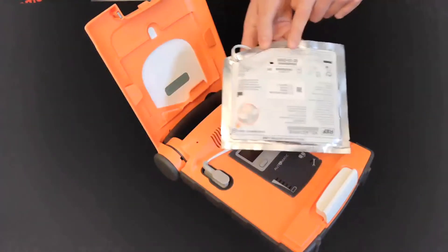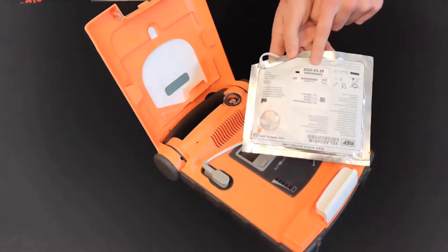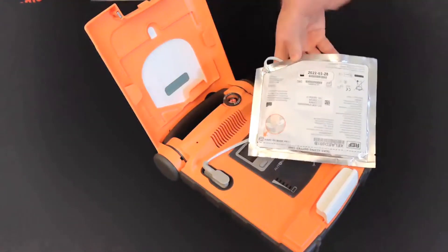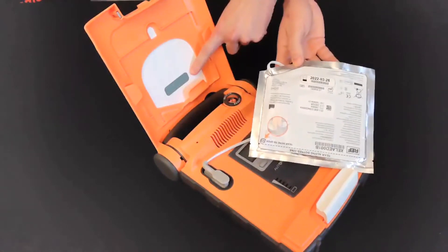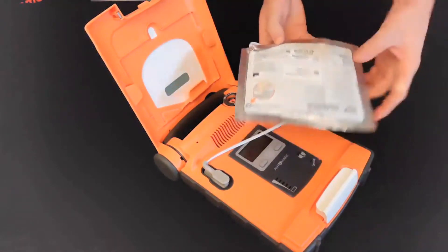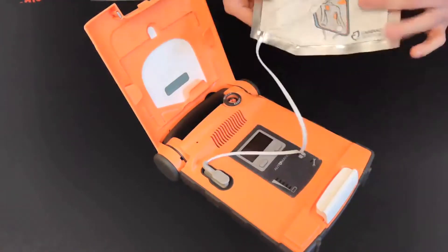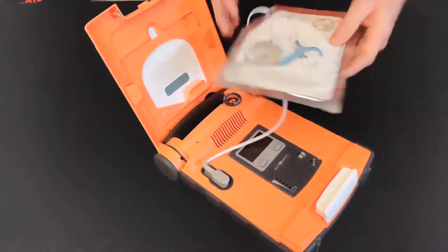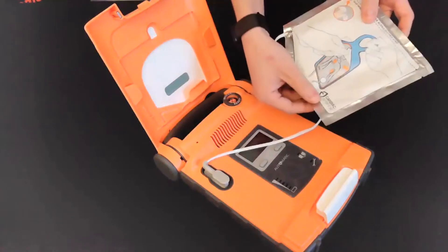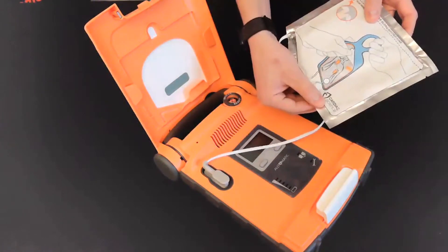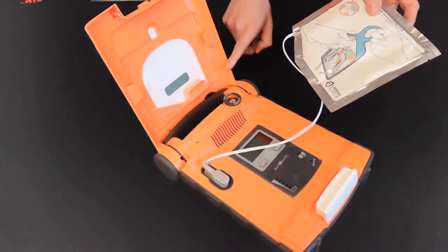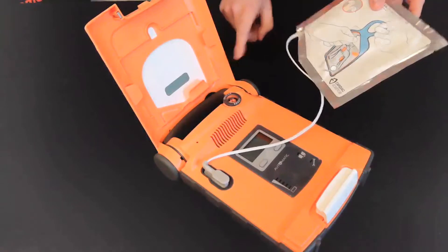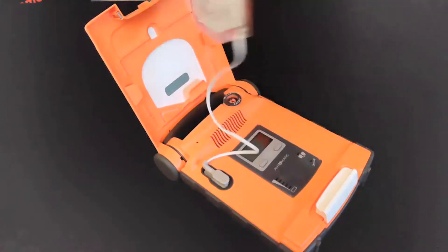When placing the new pads into the guide rails on the lid of the AED, make sure the pad expiration date lines up with the clear window on the lid. An easy tip for proper placement is to have the Cardiac Science logo on the back of the pads in the bottom right corner of the lid facing you.